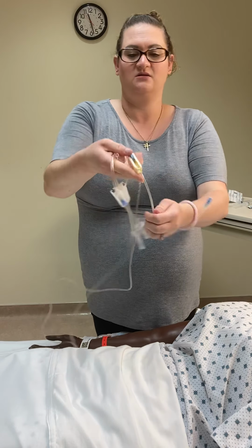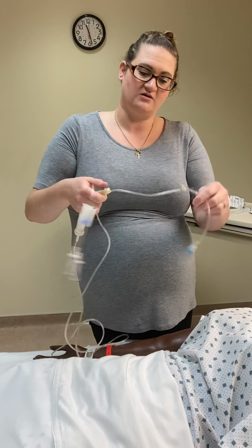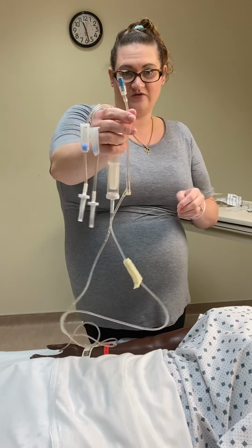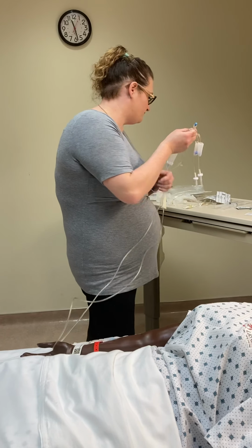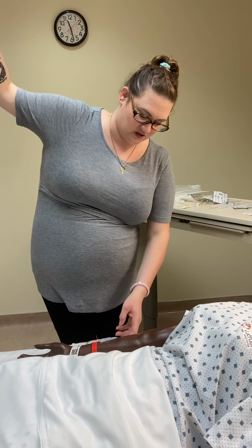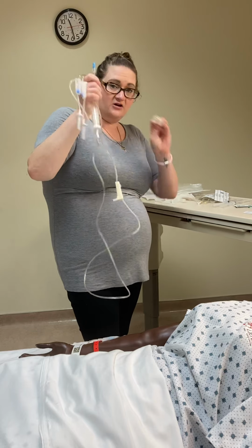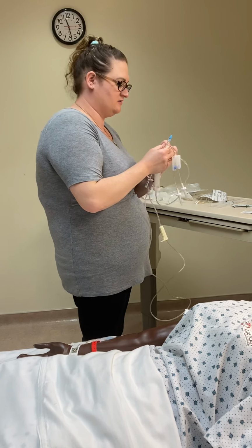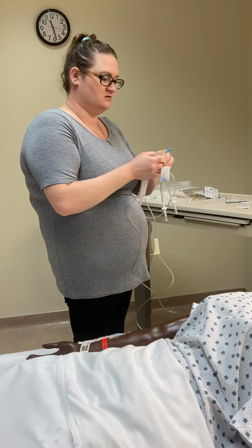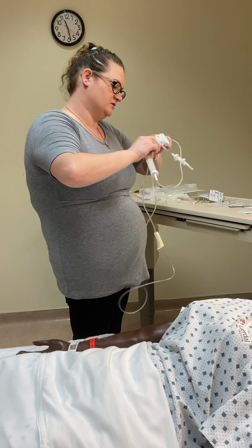We have our main roller clamp down here, which is when we're doing by gravity, this is what we're gonna use to adjust how fast or how slow we're going. And then of course we have the end here. Since we are going to be using a simple connector, I'm gonna have to put an alligator clamp on the end of this. I have all my clamps closed right now.